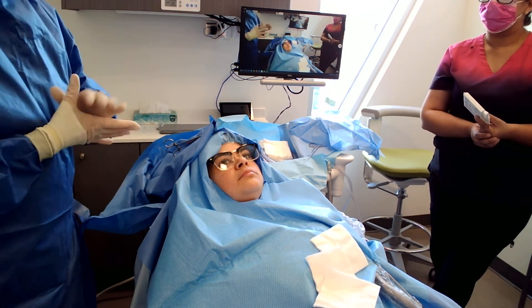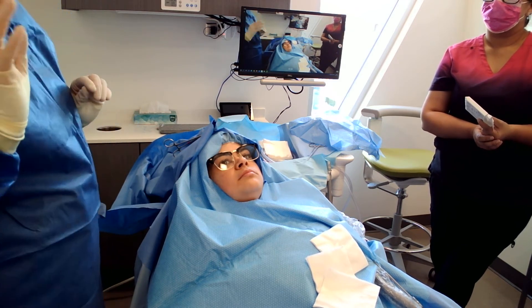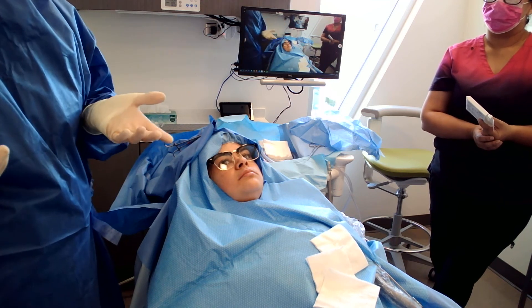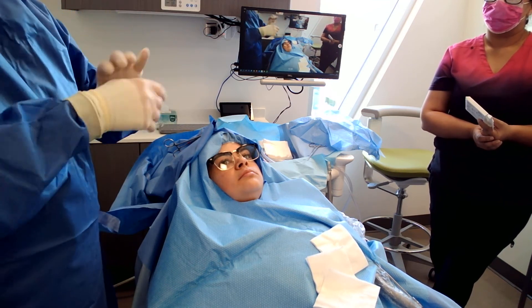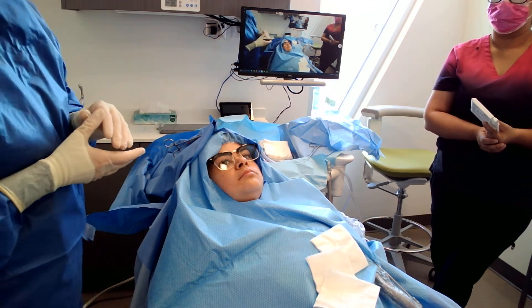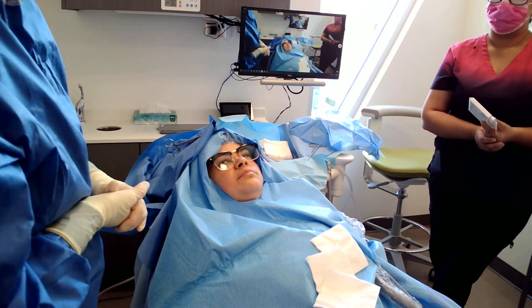Once implants are in place, everything looks good, sutures are in — we're done. End of procedure. The dentist or surgeon takes off his gloves and says he wants a post-op panoramic x-ray and a follow-up in two weeks. Then we start uncovering Courtney, sit her up — not too fast.